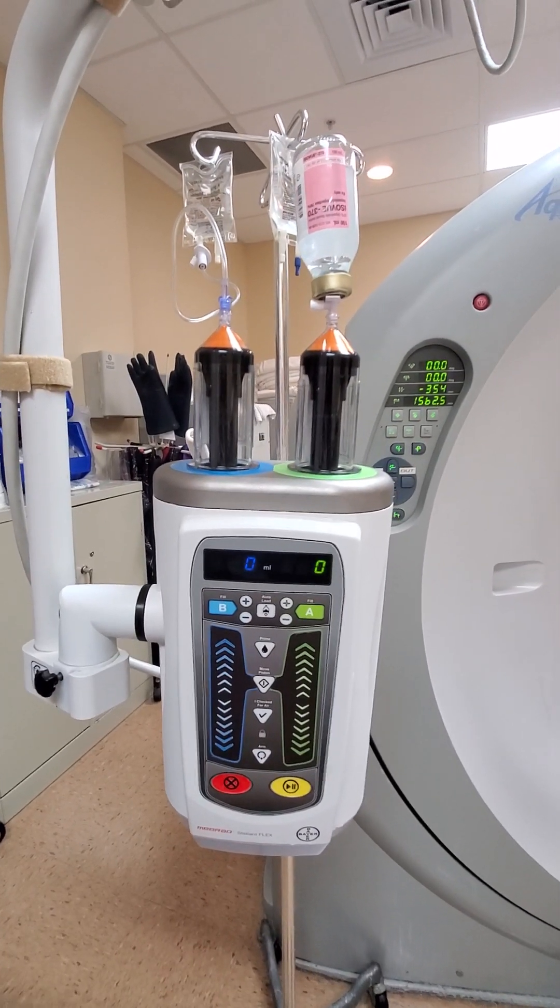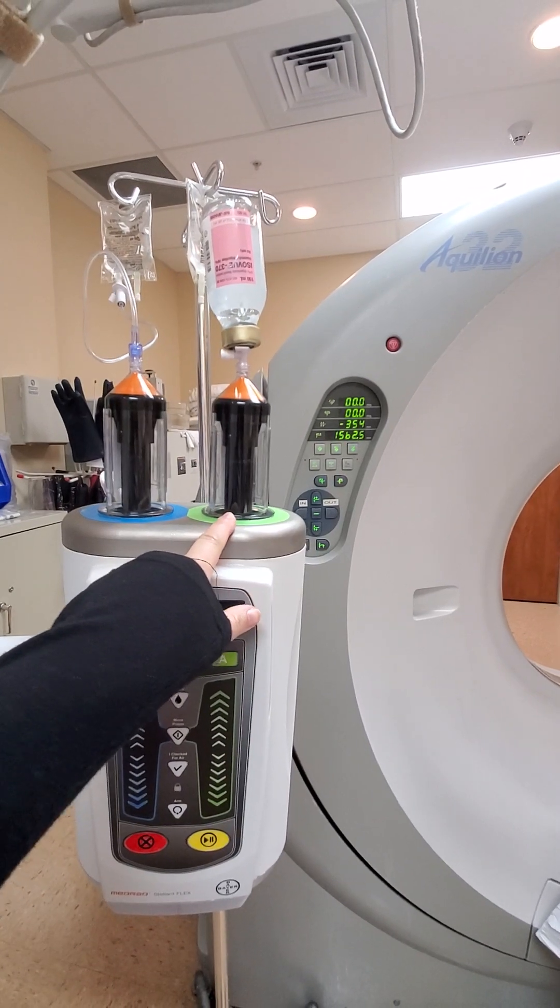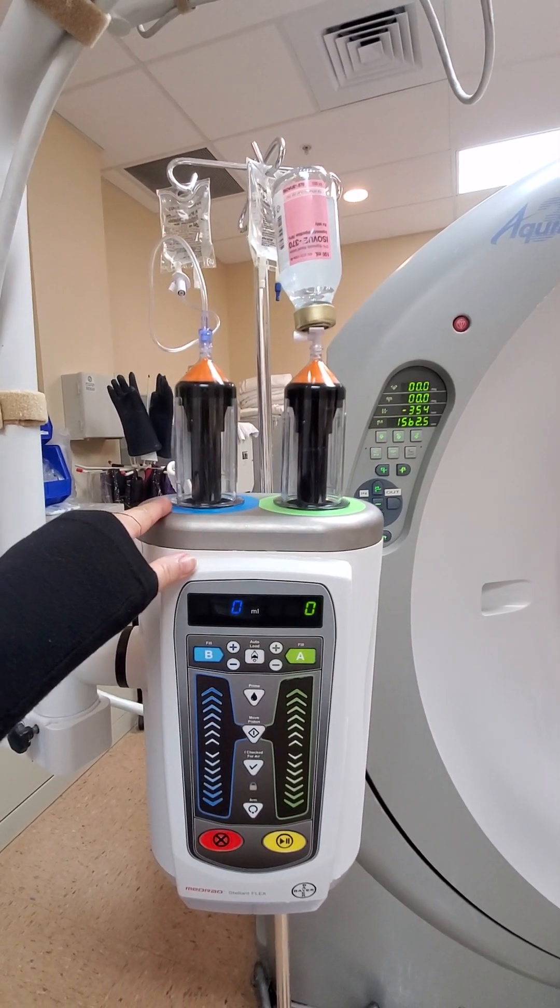Alrighty, so now we're gonna set up the injector. I have the contrast hooked up on the green side and the saline hooked up on the blue side.